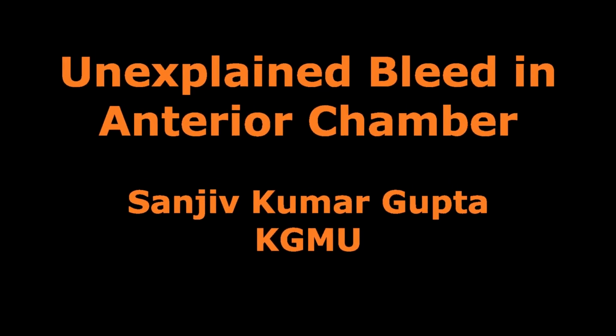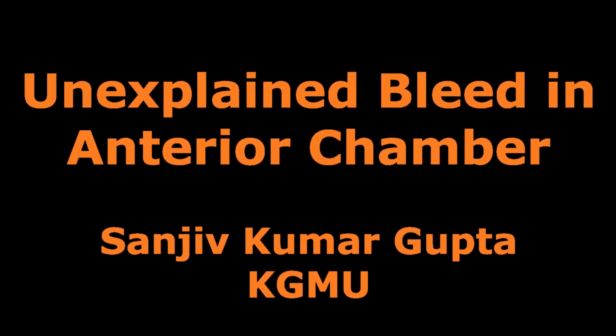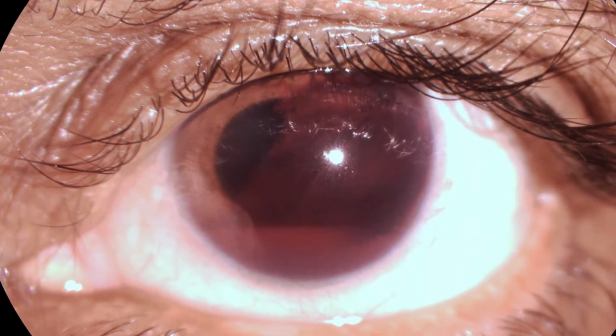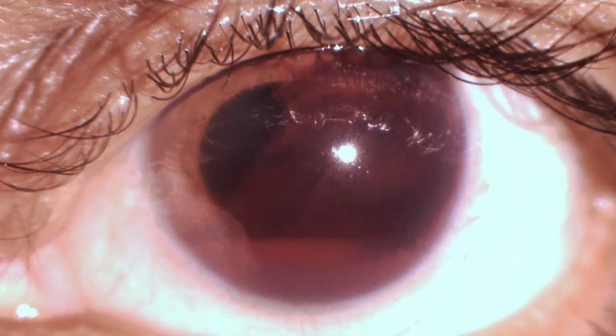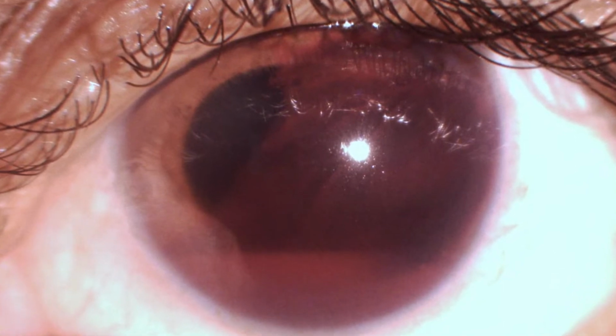This is one patient who had an unexplained bleed in the anterior chamber and presented to us in OPD. Now, this was the patient's eye at the time of presentation, and we can appreciate that there is liquid blood and clotted blood in the anterior chamber. The inferior level blood, which is bright red in color, is the liquefied blood present in the anterior chamber, and above that in the temporal two-third we can see a clot. The pupil has been dilated, so we can see part of the pupil.